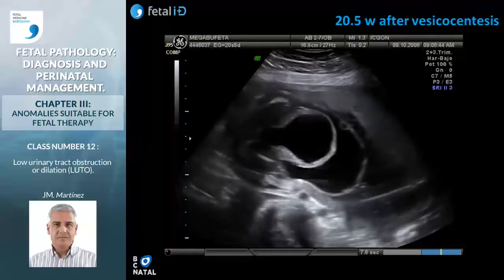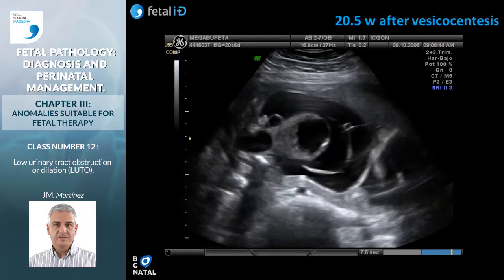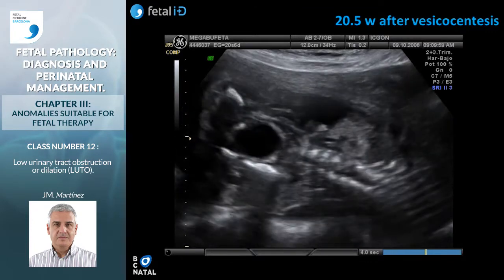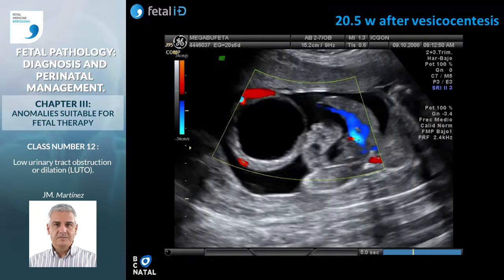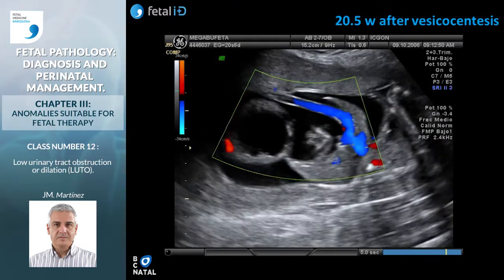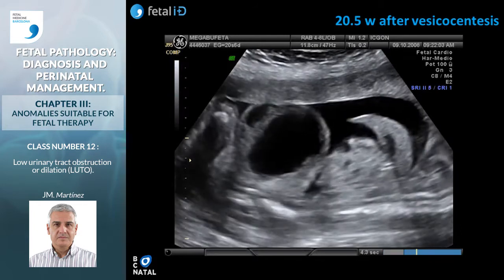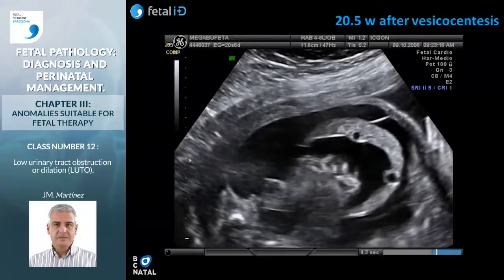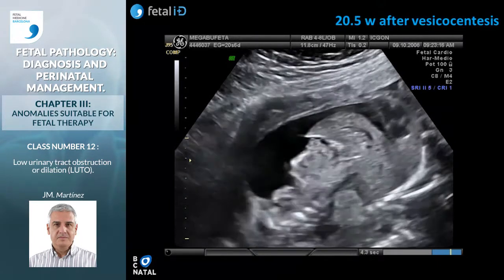In this video, we can see a case after a vesicocentesis in which the bladder was ruptured and it created an ascites in the fetus surrounding the bladder. And if we had the chance to perform a fetal therapy, we missed it due to the ascites as a result of a complication of the vesicocentesis.